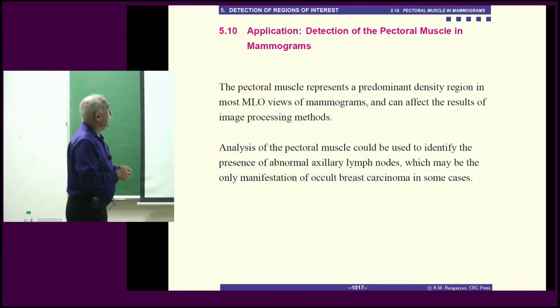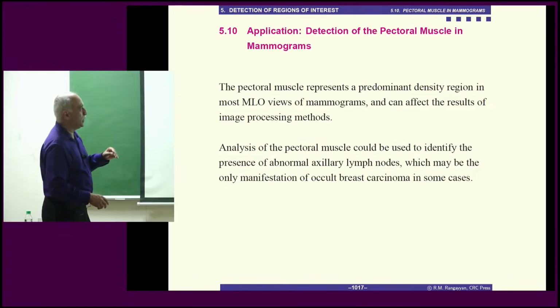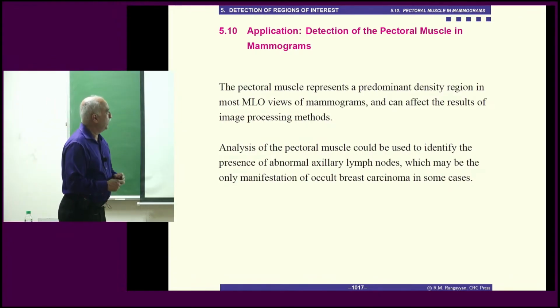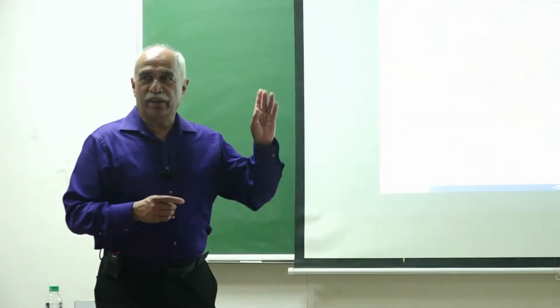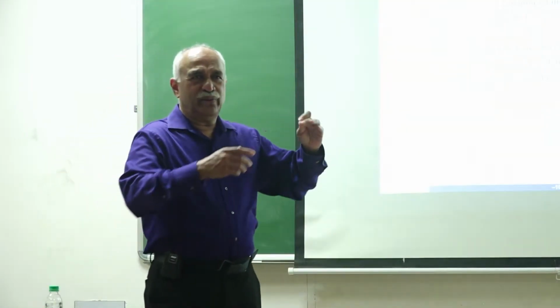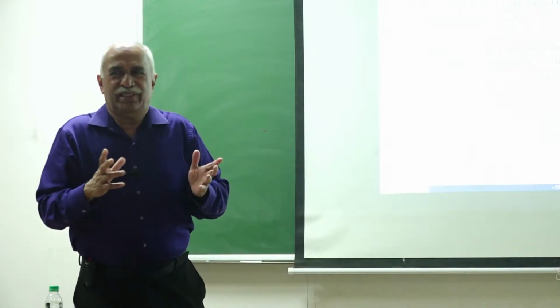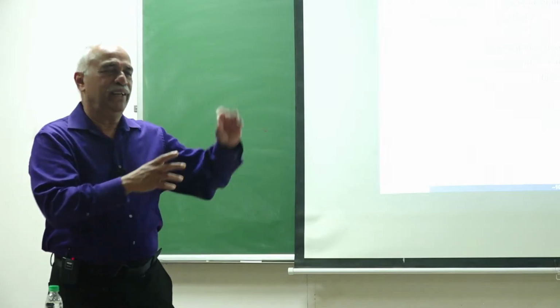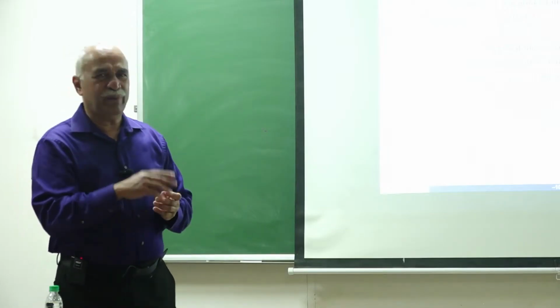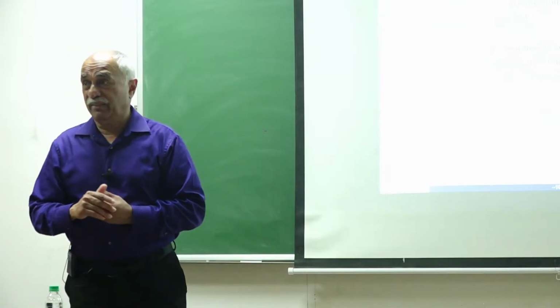The next application is detection of the pectoral muscle, which I showed in these MLO mammograms, but we will take that up tomorrow, 4 o'clock. Sorry, I rushed through some of these, but I don't want to read all the equations. Sometimes I feel reading all the equations doesn't make much sense. I'll show the pictures and explain what is happening. Some of the equations describe the parameters of the methods, and you could read those yourself later from the notes.